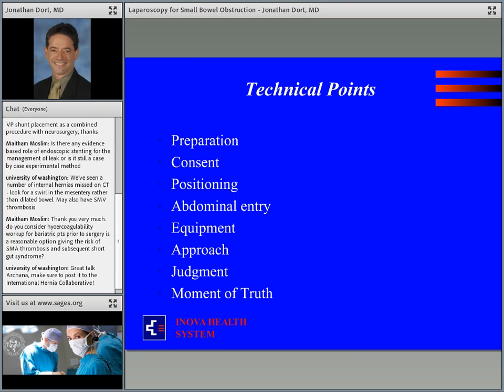Make sure you have angled laparoscopes available to you, because the vision does become poor when bowel is dilated, and adhesions can be stuck in areas that are sometimes difficult to see. Make sure you have true atraumatic bowel graspers. If you ask for graspers, you can be surprised by what you might be handed. You don't want anything with teeth or ridges or things that may already damage compromised tissue. Laparoscopic shears that work.